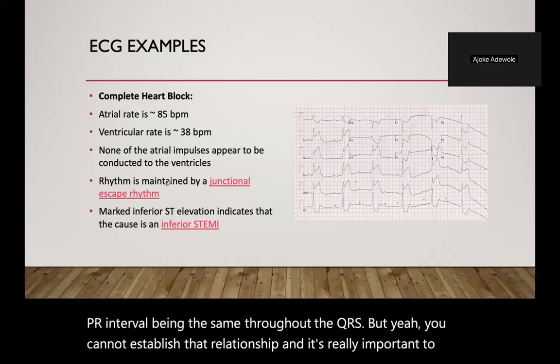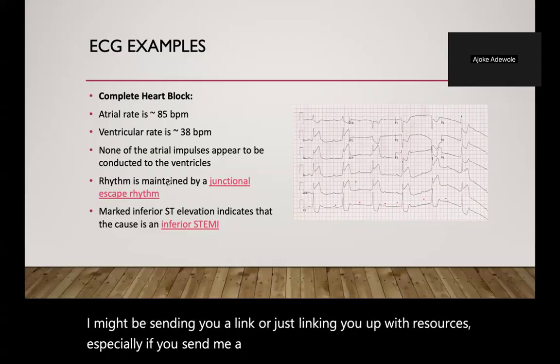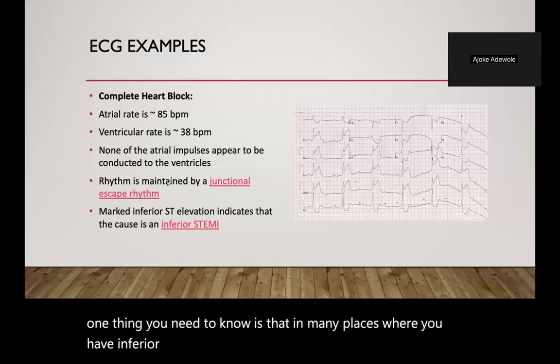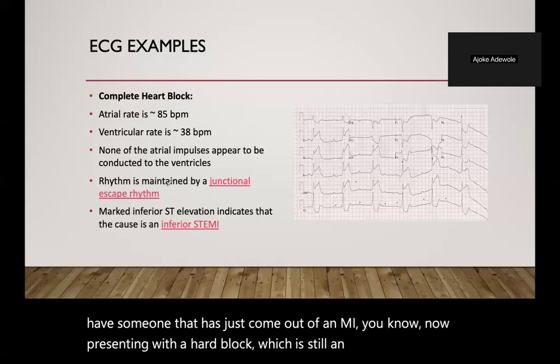I might be sending you a link or linking you up with resources, especially if you send me a message, to have classical complete AV block signs, because you need to start with the simple ECGs before you go to the more advanced ECGs, right? But one thing you need to know is that in many places where you have inferior MI, you could have a complete AV block, or you could have someone that has just come out of an MI, now presenting with a heart block, which is still an emergency.